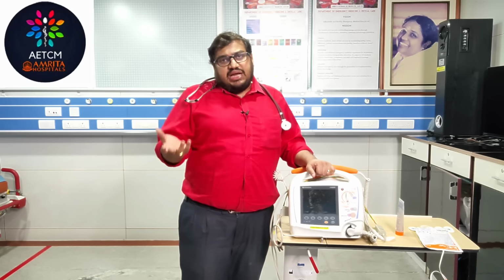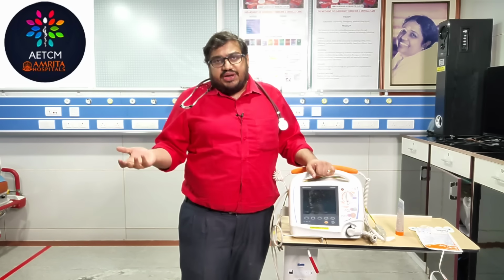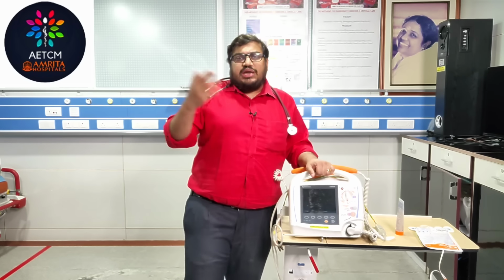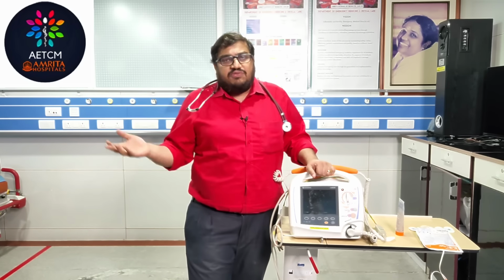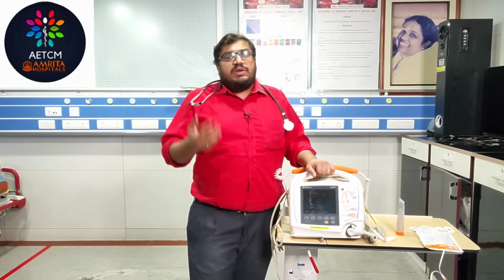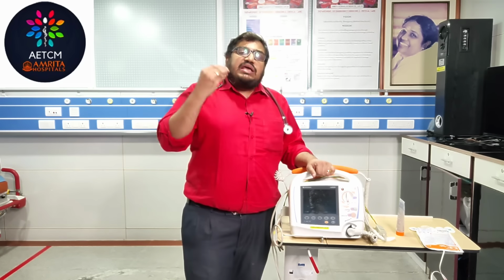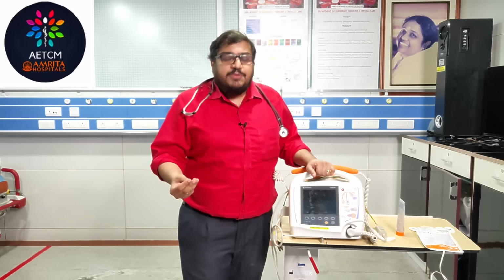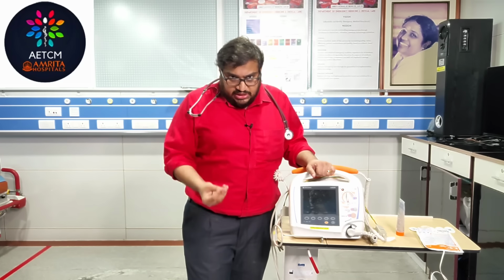So when you have a tachycardia, that is heart rate more than 100, and in case of an unstable tachycardia, it will usually be above 150, whether it is an SVT, AF or multifocal atrial tachycardia. In that scenario, if the patient is unstable, I said what are the signs of instability, you have to cardiovert the patient.